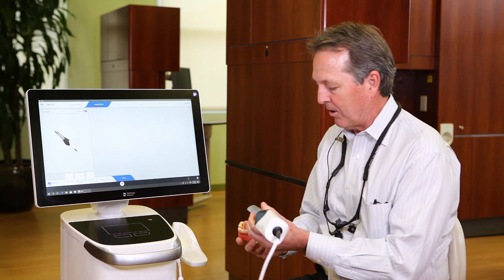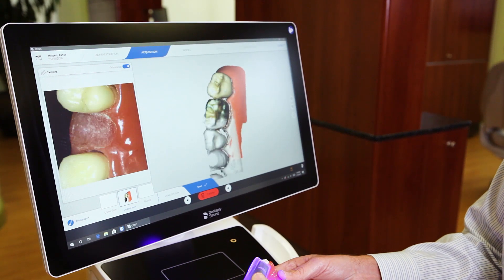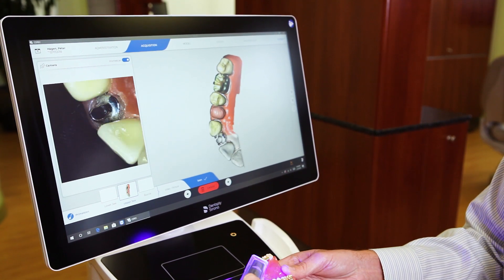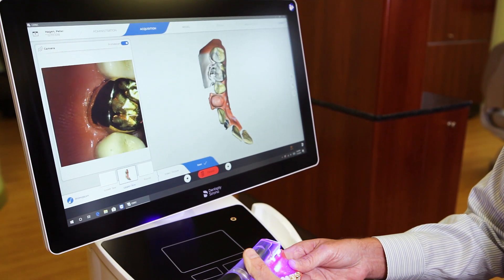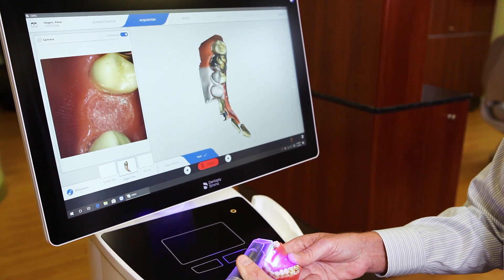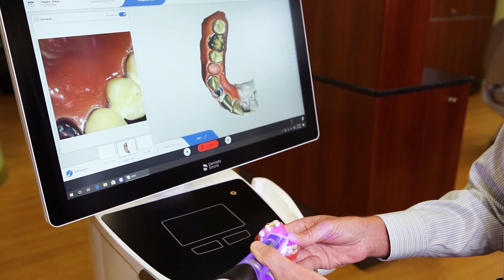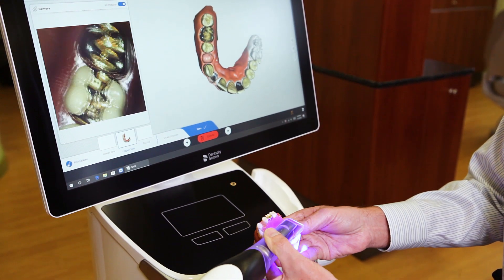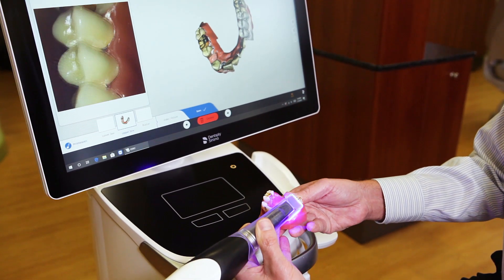So I'll start scanning — this is how we do it with the PrimeScan. Start on the lingual, give ourselves a good lingual scan up to the midline, and then head on back and do the occlusal and buccal. For the PrimeScan, it's not necessary to go 90 degrees on the buccal or lingual — more like 40 degrees off the occlusal table seems to do a better job.